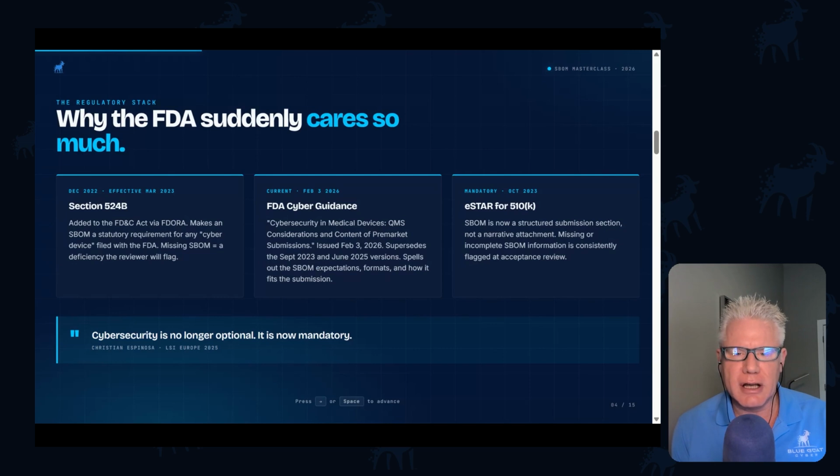And we see a lot of deficiencies today. Last week, we had a couple clients, or a couple prospects, that had tried to submit a 510K submission. They did not do their SBOM properly, and they received a deficiency, and they came to us to try to help with that deficiency. So if you have a cyber device, which means it has software and any way to connect to it, you have to do a software bill of materials as part of your submission. And this is, as I said, no longer recommended or optional.